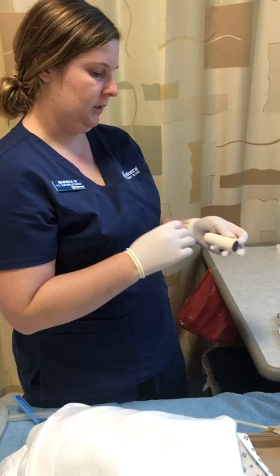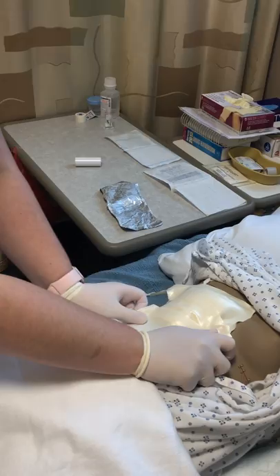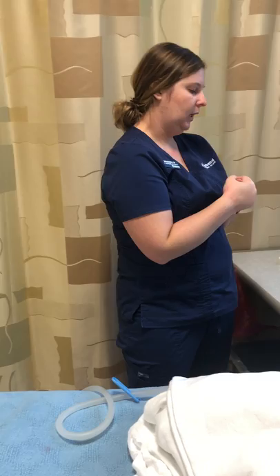When I'm finished putting on the tape, I am going to label my dressing. I'm going to label it with the date, my initials, and the time that I did it. So I could use this tape, place it on, and do the labeling. When I'm done with that, I will remove my gloves and wash my hands right away.